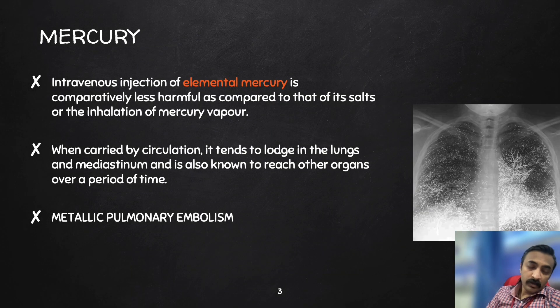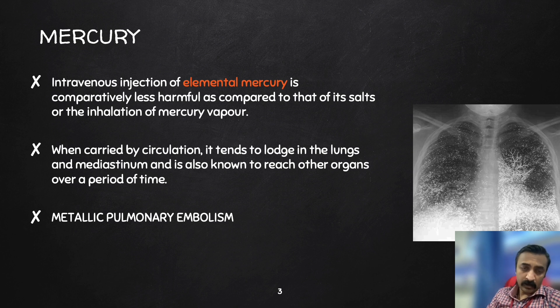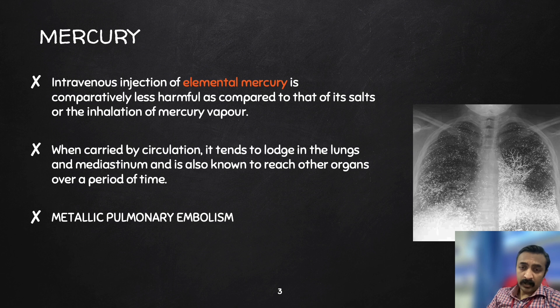The answer is intravenous injection of elemental mercury. You can see that the pulmonary vasculature is lit up on the X-ray because of the elemental mercury. Usually, compared with other forms of mercury intoxication like inhalation, intravenous injection could be relatively harmless to the person who has injected it.